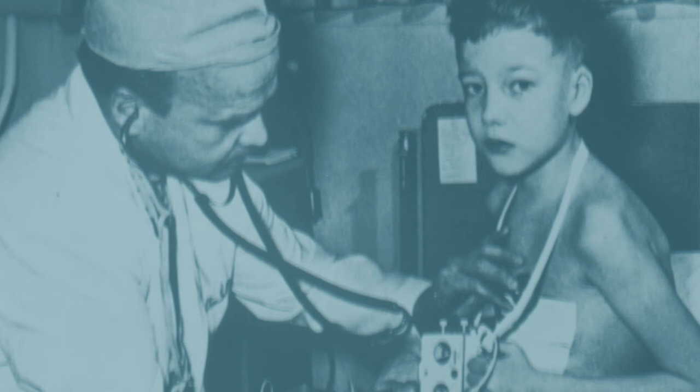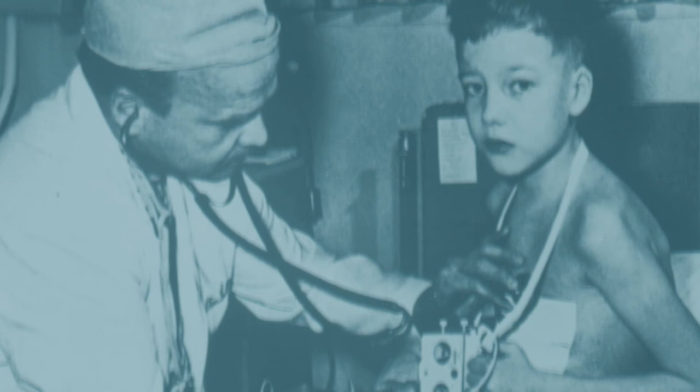Within four weeks, the Medtronic team had created a revolutionary wearable pacemaker that immediately began saving lives. And a year later, Medtronic produced the first implantable pacemaker.